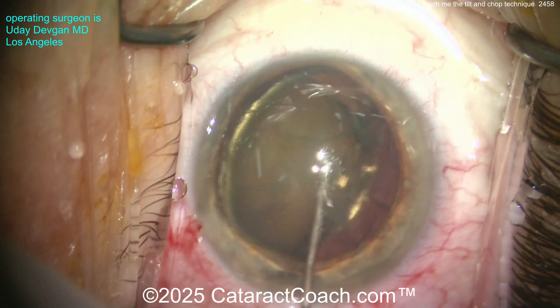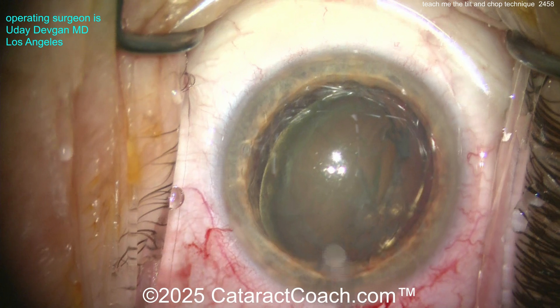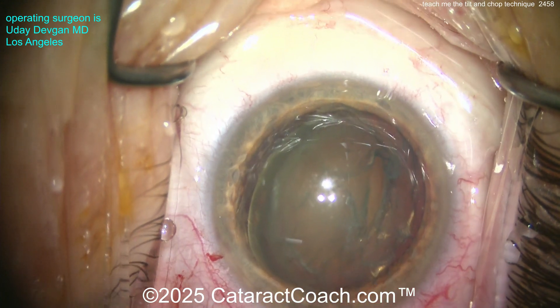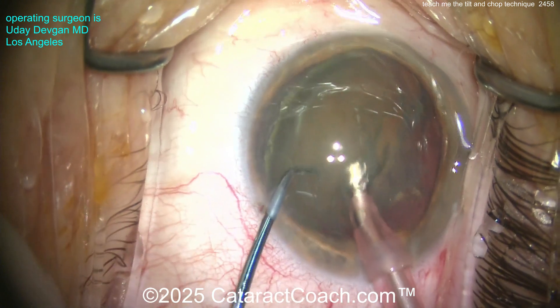Now here we go — slow and steady hydrodissection, not forceful, very slow. There's the nucleus prolapsing out of the bag. Notice the hydrodissection is to the side of the nucleus — don't go right down the middle, because then you'll block the nucleus from coming out of the bag. The nucleus is not flipped upside down; it's simply tilted partially out of the bag.